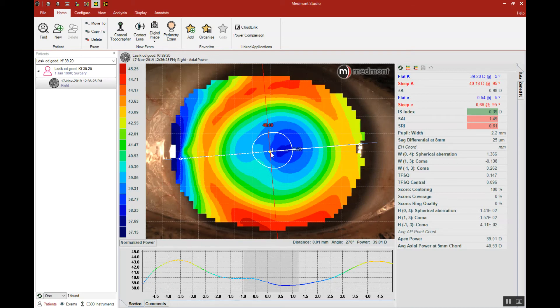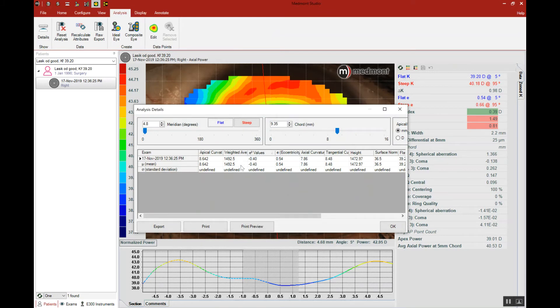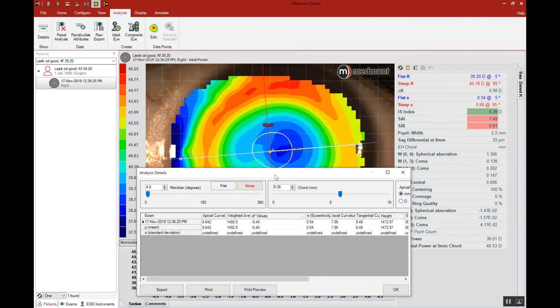In this case, to understand the oblate surface, we would go up to Analysis and Details. With this window open, let's concentrate on the third window over — that's the E-squared value. E-squared will provide us with an understanding of the difference between prolate and oblate surfaces. When you have a positive E-squared value, that will describe a prolate eye. When you have a negative E-squared value, that describes an oblate surface. So here in our post-LASIK patient, the E-squared value describes the cornea as oblate with a negative E-squared value.